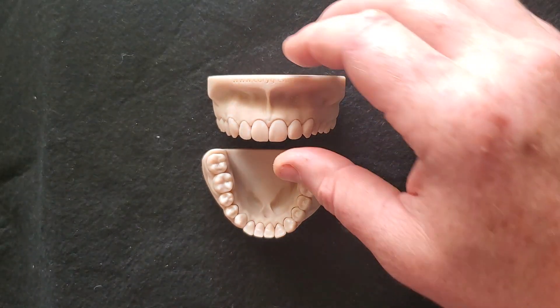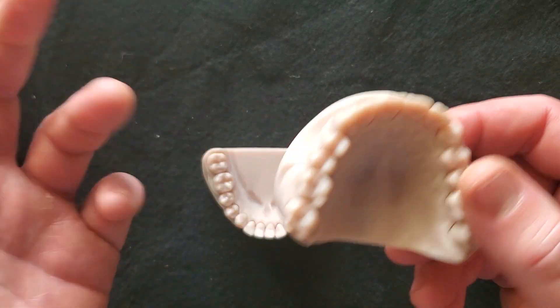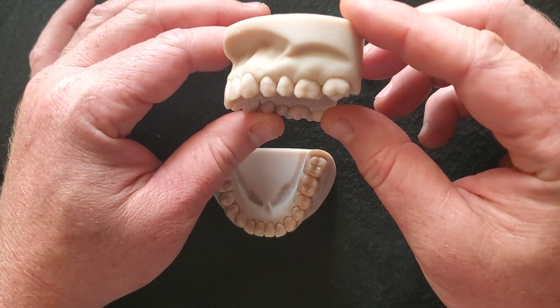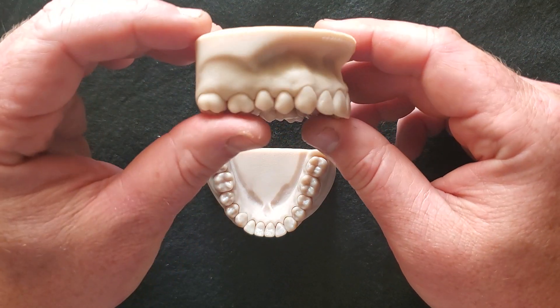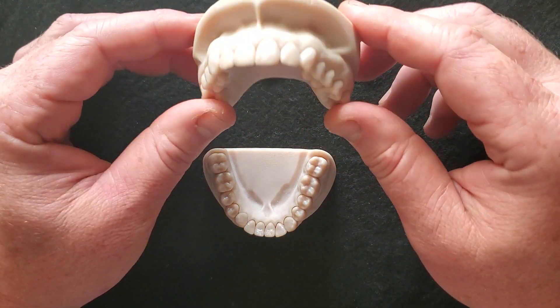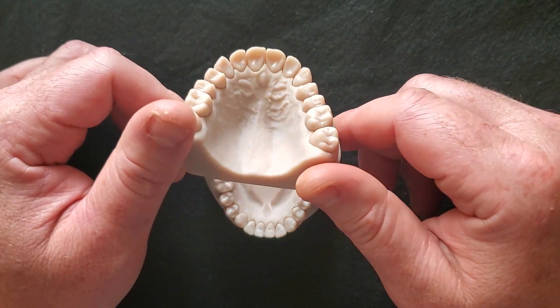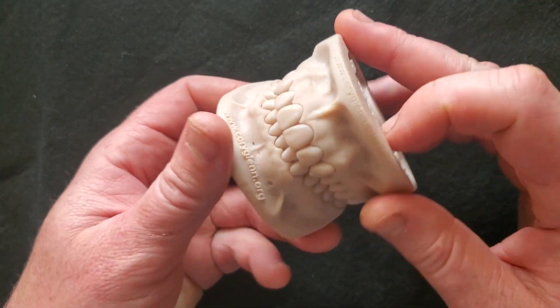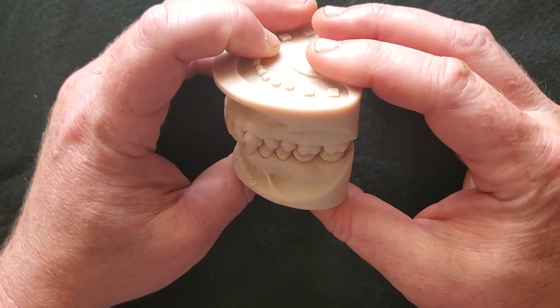Hey, this is Dr. Corey Glenn, and I wanted to show a new thing I've come up with. These are Typodonts that are actually 3D printable. I'll try to post in the comments where you can download this — it's an STL that I'm selling. Basically, this is going to allow you to generate your own Typodont in-house.